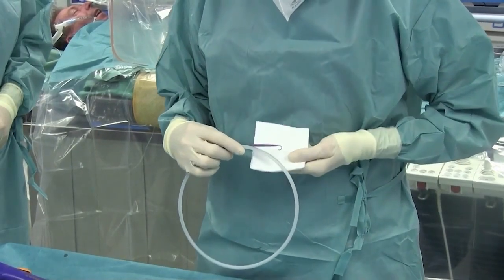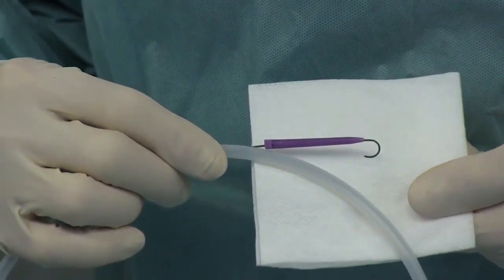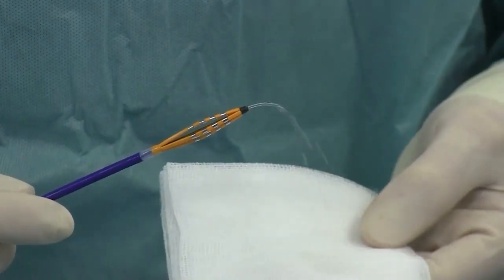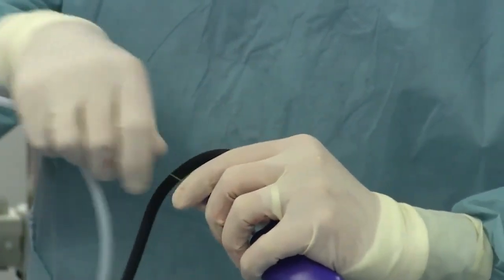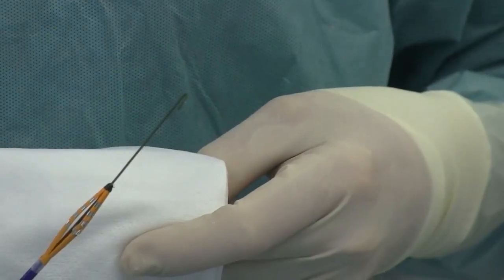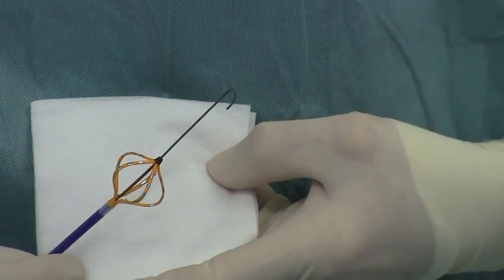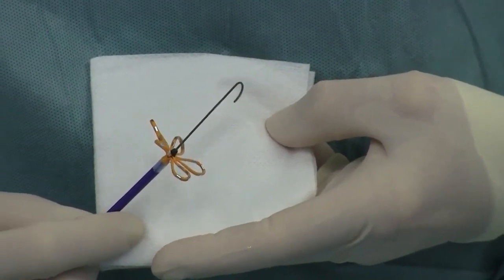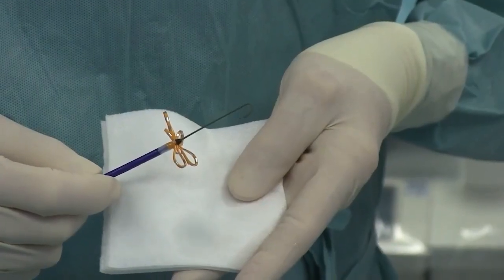A stiff wire with a J-shaped tip is used for anchoring the catheter inside the PVs. The Farawave is first flushed with saline and then the stiff wire is inserted. With the wire inside, different configurations of the catheter tip may be tested, the basket and the flower. The proximal portion of the catheter is also flushed with saline.